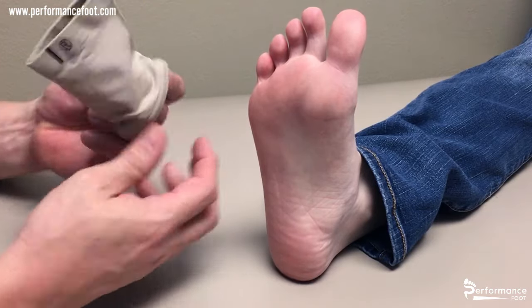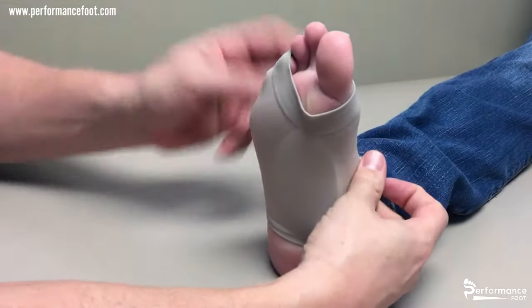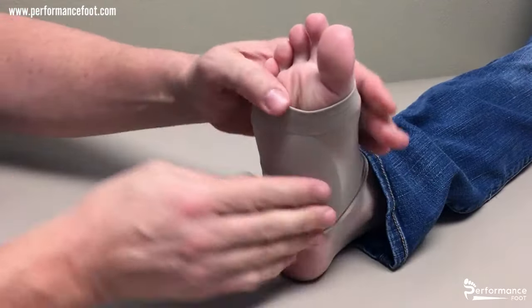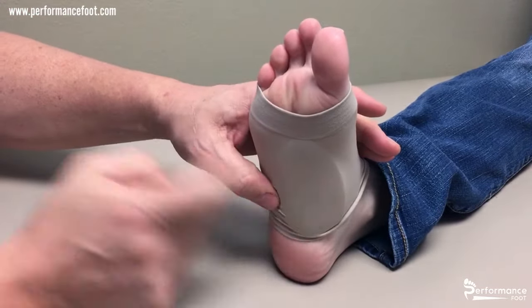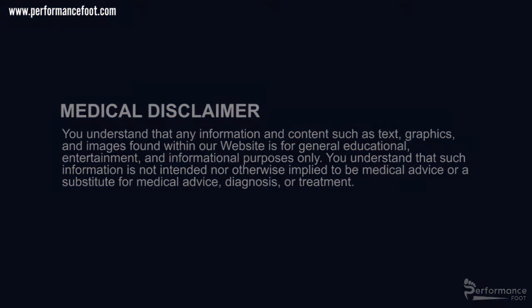In order to use it, slide it directly over the top of the foot so that the pad is within the arch. Thank you.